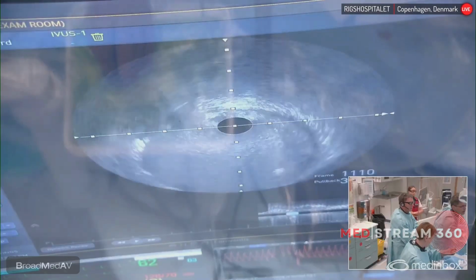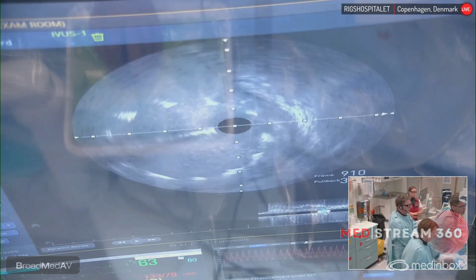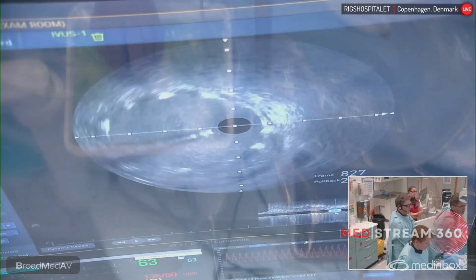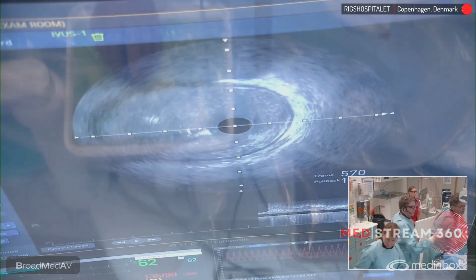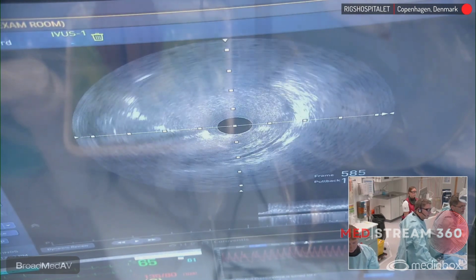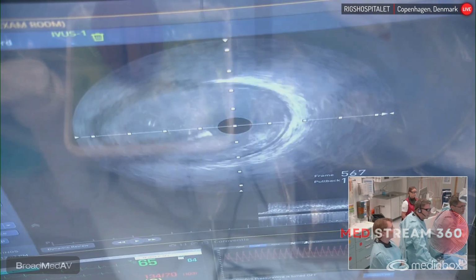From what I just saw, we are just at the ostium of the diagonal. Left main is good, and at the ostium of the circ, here's the circ coming in. I don't think you should do any manipulation of the ostium of the circ with a kissing balloon, so I don't think you should rewire it. Yeah, but that's because the stent tends to go a little bit towards the ostium of the diagonal, as you can see here. Yeah, because you have the plaque there in the bottom.